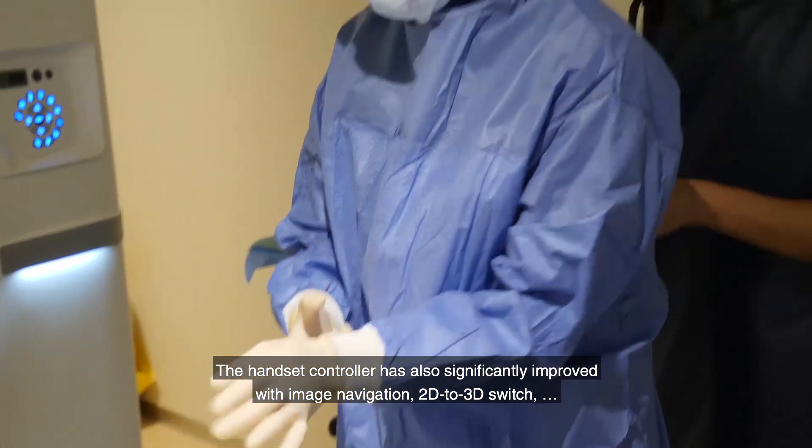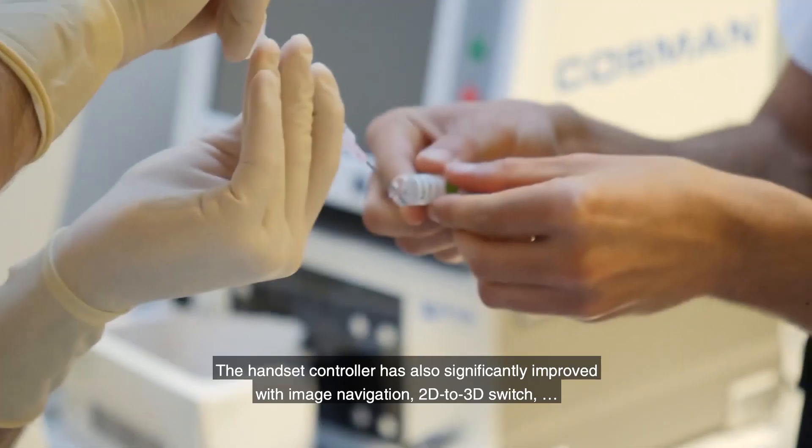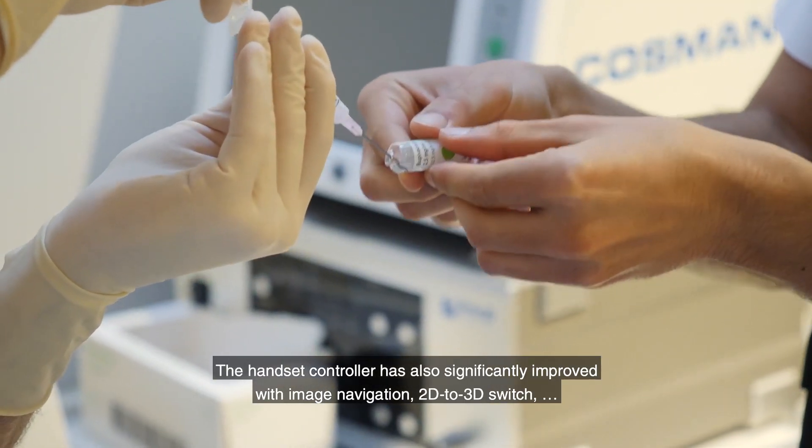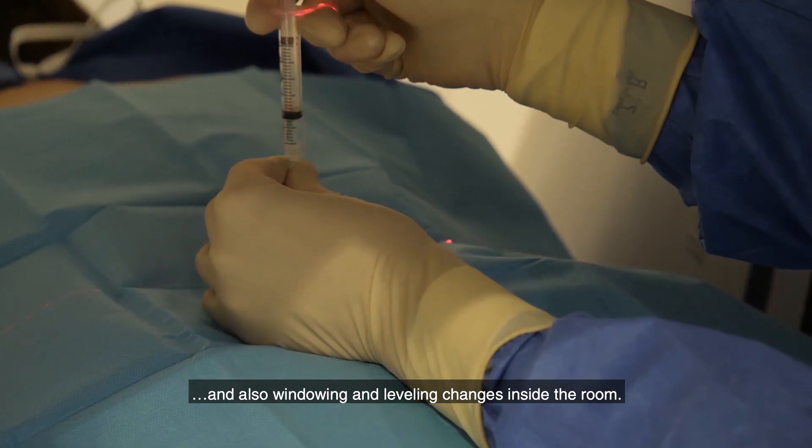The handheld controller has also significantly improved, with image navigation, 2D to 3D switching, and window and leveling changes available directly inside the room.